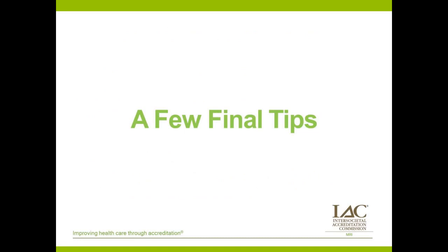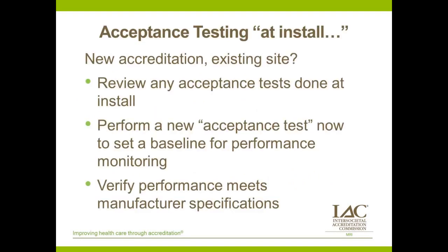Last couple of things, and I see we have some questions, so I want to make sure we get to those. If you look in the standards, you will see that the acceptance testing is required to be done at the installation of a system.